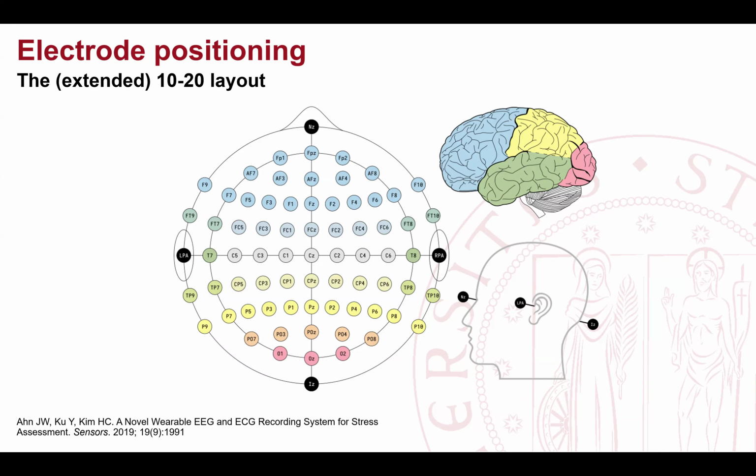It depends on the EEG cap, so it depends on the system that you buy. There are certain systems. Normally, for example, GTEC has the earlobe as the default. Antneuro has CPZ, but they also allow you to change it. You can buy an additional element that allows you to change the reference electrode and place it, for example, on the earlobe. But you can choose it, and it should be said in the paper.